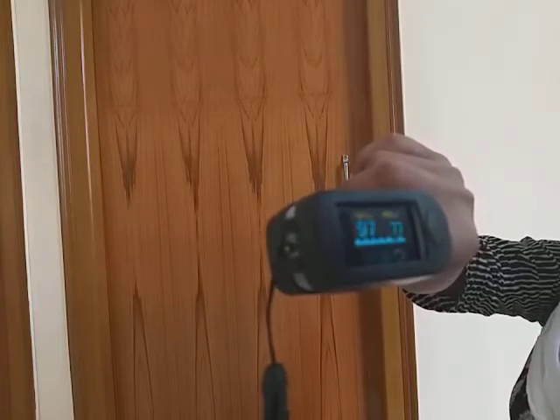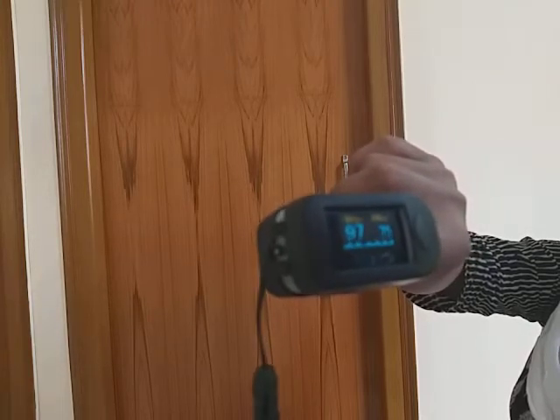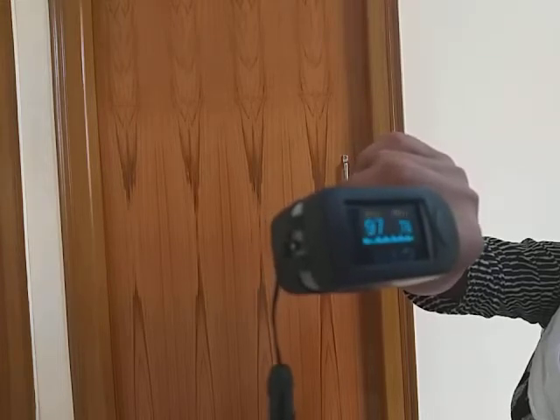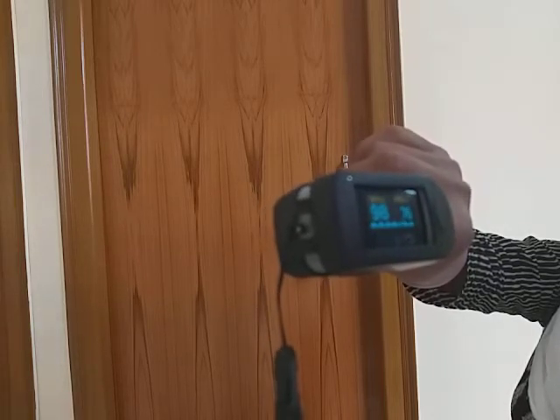So there is a 1% dip in saturation. This dip is called desaturation, and the maximum desaturation in the course of observation is called desat max. This 1% desaturation is perfectly normal and it can be ignored. Now again, the pulse rate is 76 and saturation has come up to 98%. This is exactly what happens in normal people.